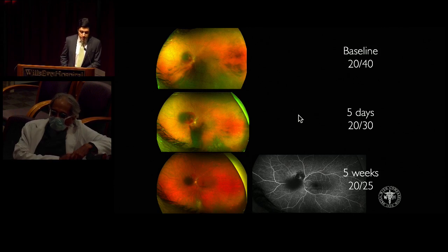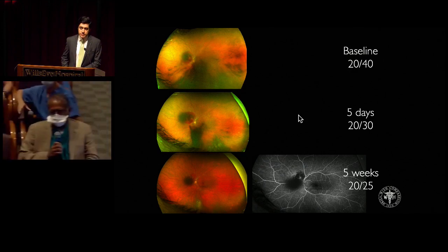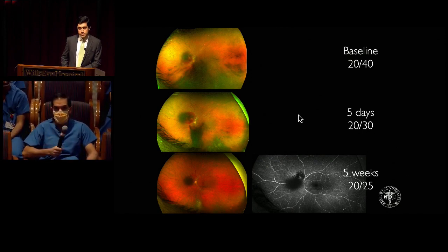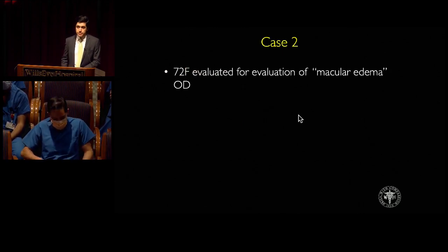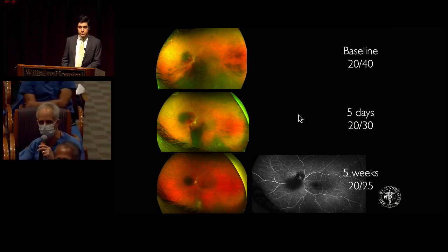Do attendings tend to typically take follow-up FAs to look into exudation patterns? No. Really, I don't. I mean, you can clinically see if there's going to be exudates or not. So just follow them clinically. I don't know if I see much value of fluorescein angiogram on presentation either, quite honestly. Excellent. Okay. Good news is the ones that are nasally located very rarely cause significant problems.